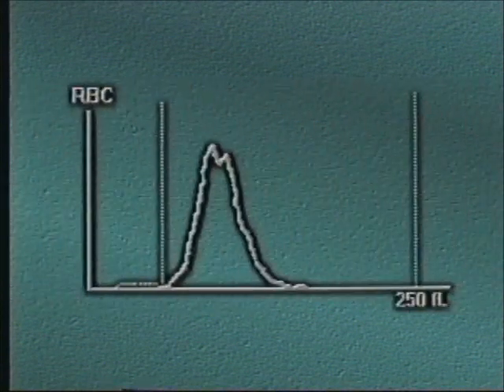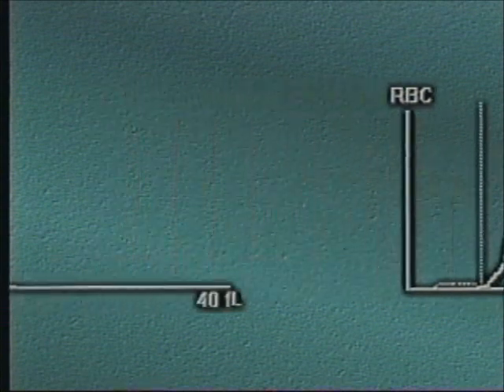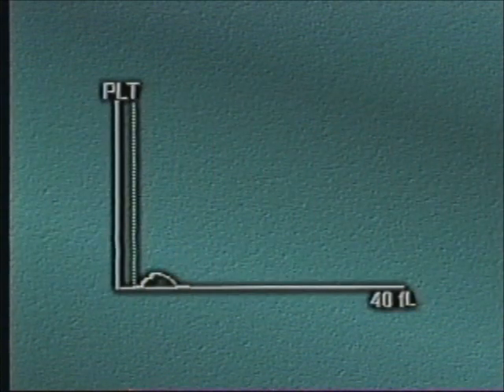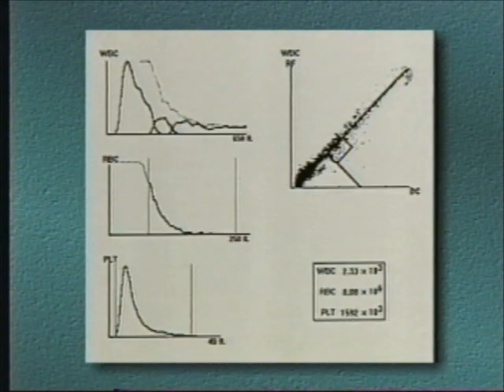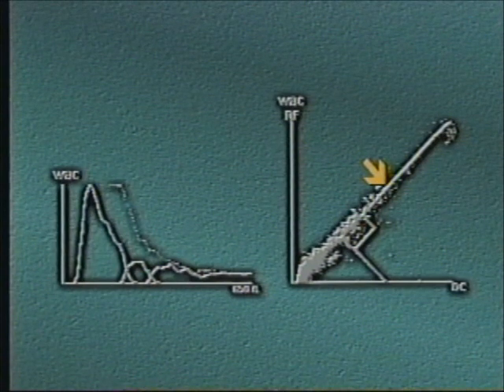If this fluid were from a CSF, the red blood cell count would be acceptable. The platelet channel shows no interference. This example on the same 5-part analyzer shows an unacceptable result. The discriminator on the scattergram shows obvious interference, and there is no clear separation between what may be debris and what may be cells.